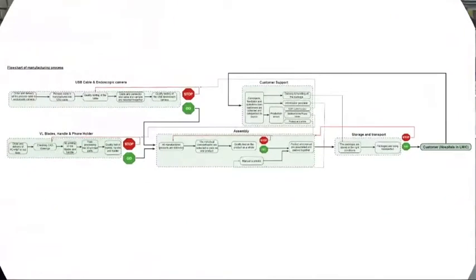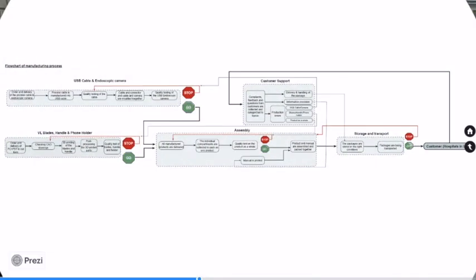For the manufacturability, a flowchart was made to outline the most important checkpoints. The PC PBT blend is ordered from a third party and printed into the design pieces. Like the PC PBT blend, the USB endoscope is also ordered from a third party. And as indicated by the stop and go symbols, batch testing is used throughout the manufacturing process for quality assurance control. The third parties involved in the process are required to provide proof of conducting batch tests in regular intervals.